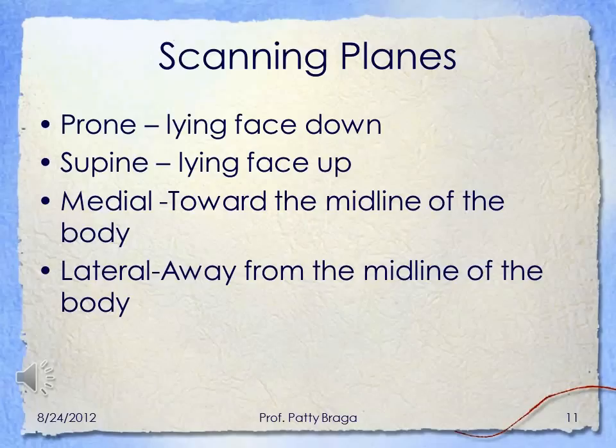You could be scanning a liver. A radiologist could come in, or even as a student, your clinical instructor will say, well, I want you to go more lateral. Which way are you going to move? You're going to know that lateral means away from the midline. So you're going to go more towards the patient's right if you're on the right side of the body. If you happen to be on the left side from midline, remember midline is the middle, then you would go more towards the patient's left side. We'll go over all this in class when you're scanning. If you don't understand any of this terminology, please speak to me in class.